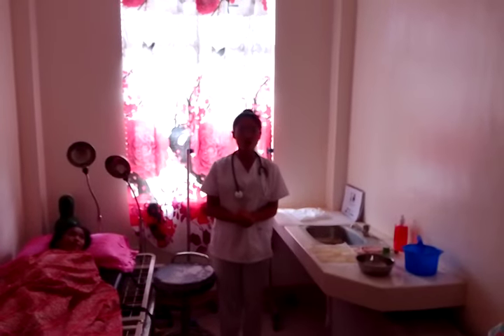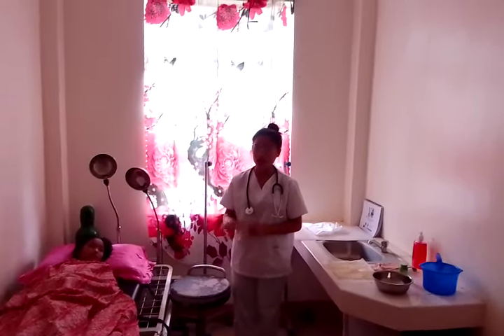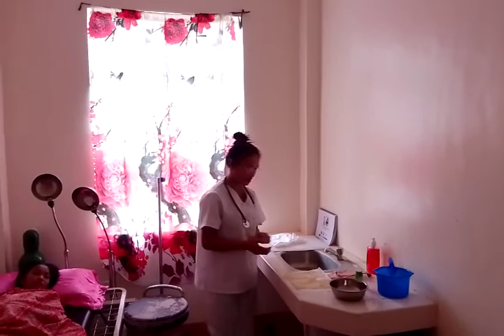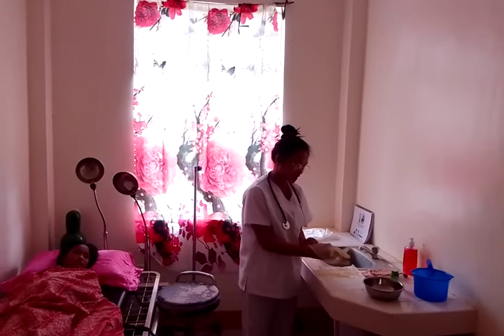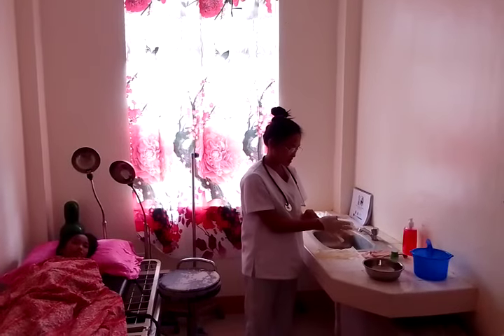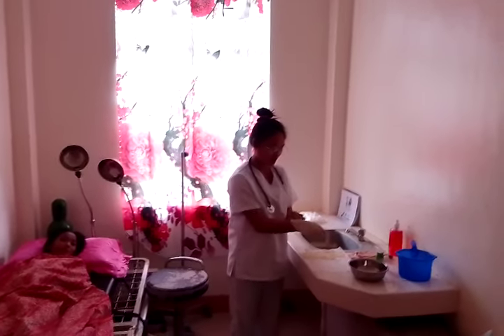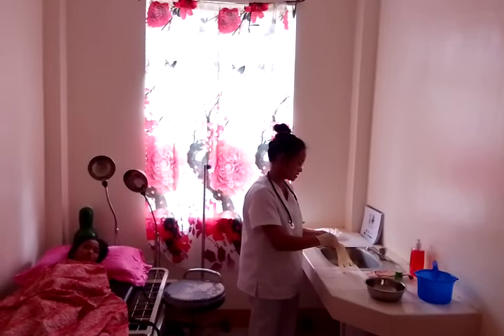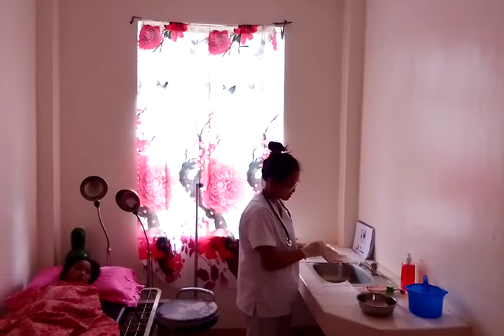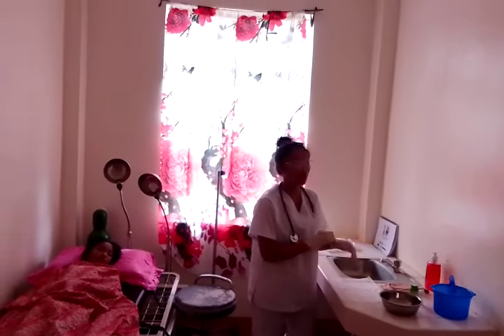After that, we need to put on clean gloves before washing. We need to follow proper gloving technique. Put on the left glove first using the gloving technique, then the right side. Gloves are now on.